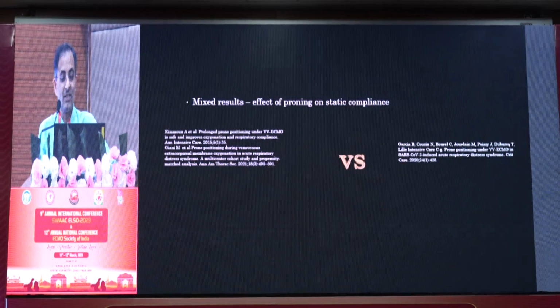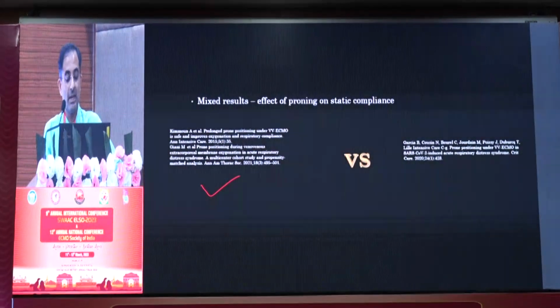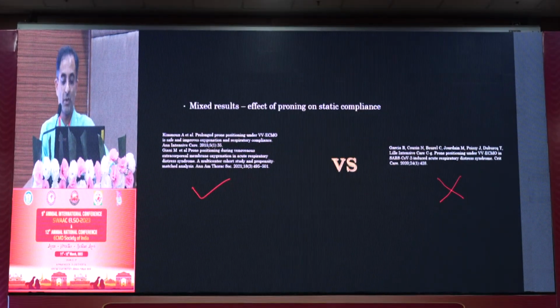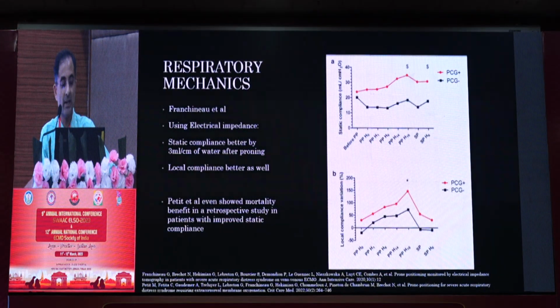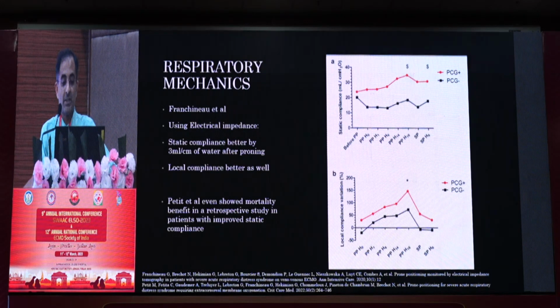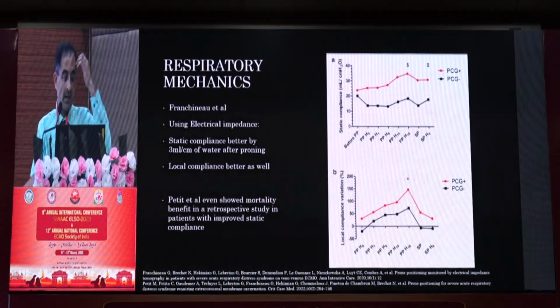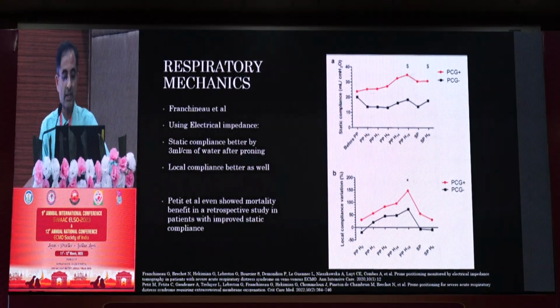The next important thing is respiratory mechanics. Now, there is data that when compliance improves with proning, the outcomes seem to be better, but not necessarily, as we see in some other studies as well. As you can see in this study, the overall improvement in static compliance by about 3 ml per centimeter of water does show that these are patients who will benefit from proning.